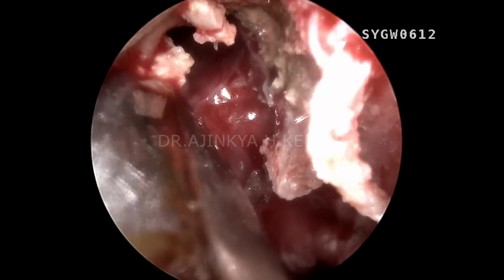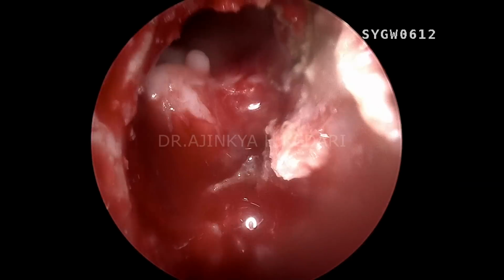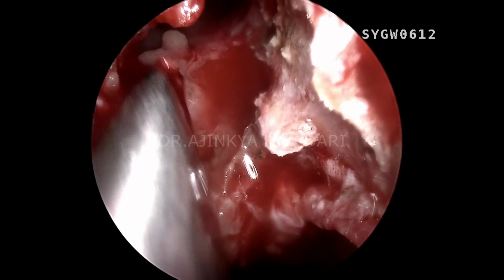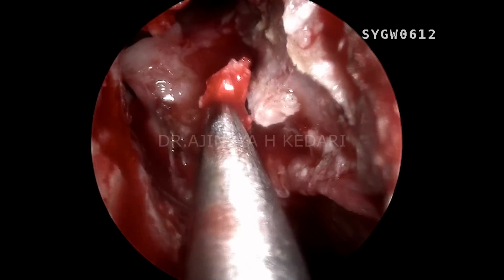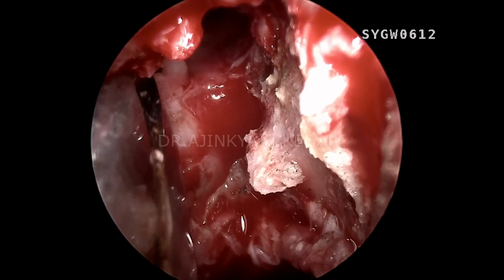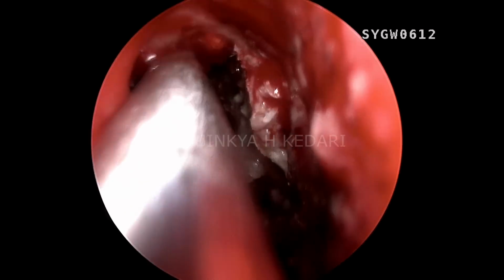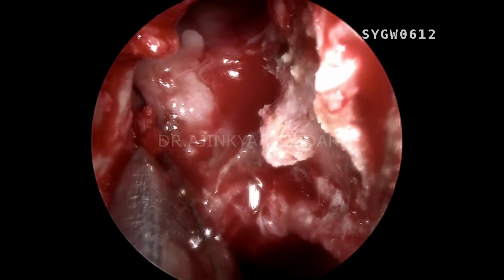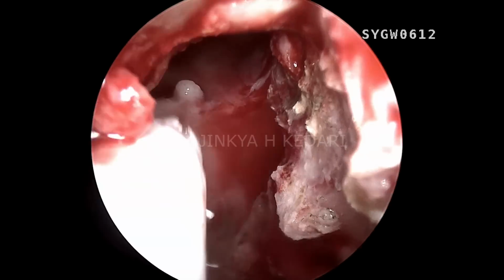So that's going to help me do the orbital transposition if I at all need to go a little above the supraorbital area. You can see now I'm pressing on the orbit and the skin from above. That is the movement, and that is all skin all around. So I've taken away the entire bone, and that is only skin near the external approach. You can see that those are little bony fragments I can just take away, and this is all skin everywhere on the lateral aspect. So I've taken away the bone completely on the lateral aspect, which is only skin right now. So this is going to help me manipulate the area a lot more easily.